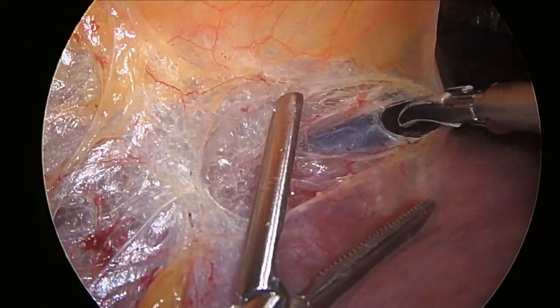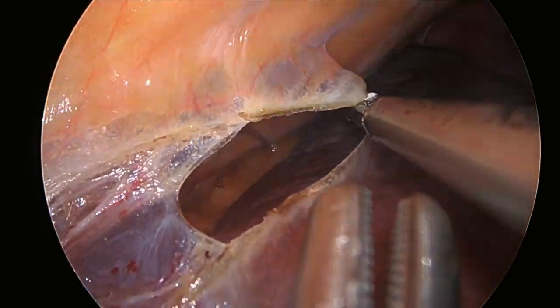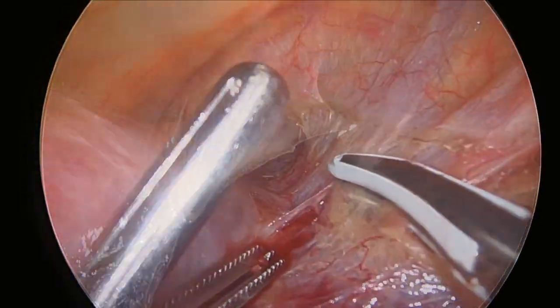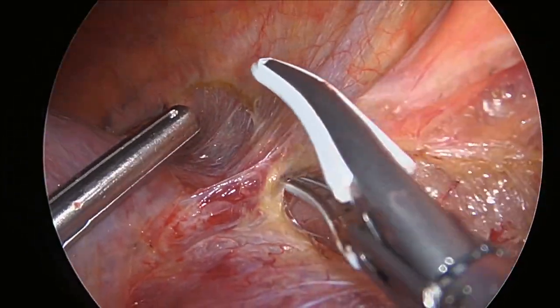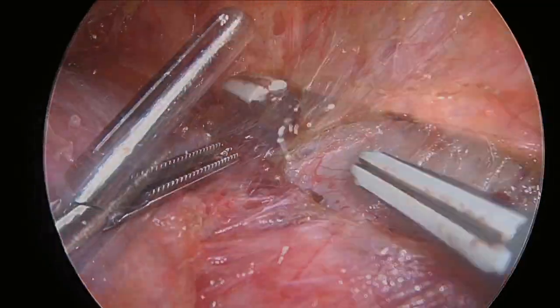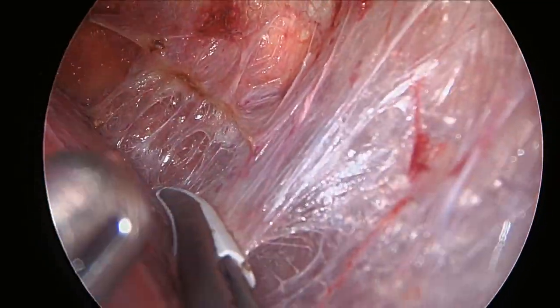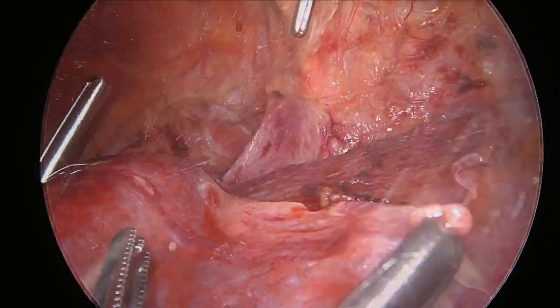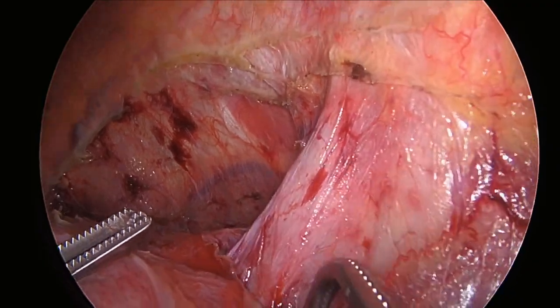First the round and falciform ligaments are divided up to the level of the hepatic vein origin. Then the left coronary ligament is divided, as seen here, and then the right coronary ligament is divided to expose the lateral aspect of the right hepatic vein. All tissues lateral to the hepatic vein are then divided as much as possible from these cranial working ports. The groove between the right and middle veins was then developed from this cranial aspect.